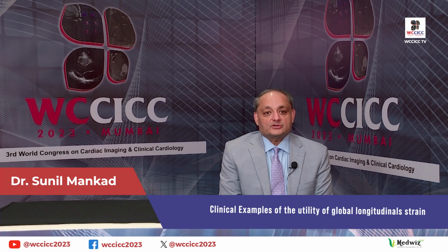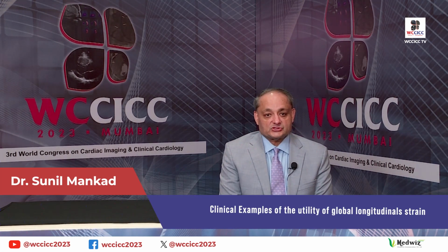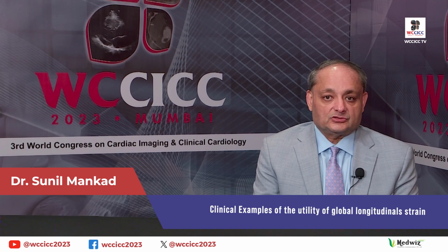We then move on to where it's clinically used currently, to separate different types of increased wall thickness, to separate hypertrophic cardiomyopathy from amyloidosis, from just hypertension. And although not 100% accurate, it certainly can point you in the right direction, and perhaps other diagnostic clues can then be obtained to separate out why heart walls are thick.